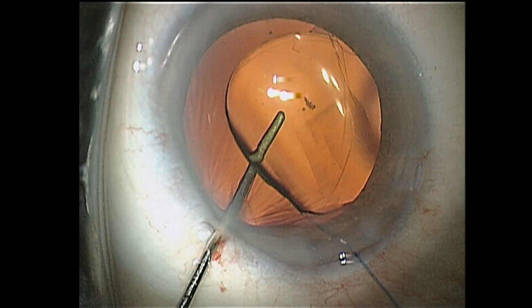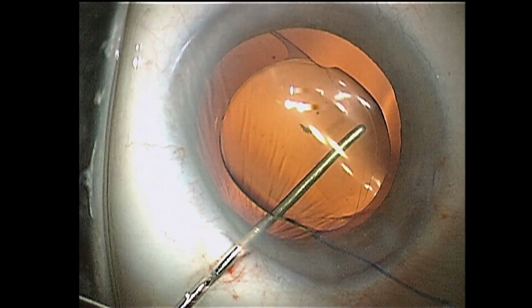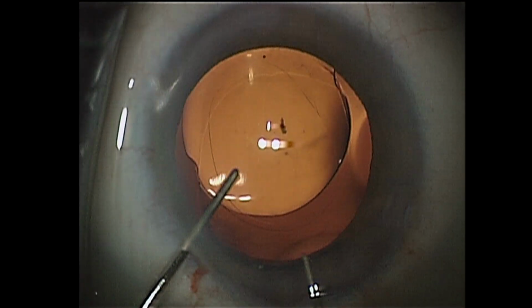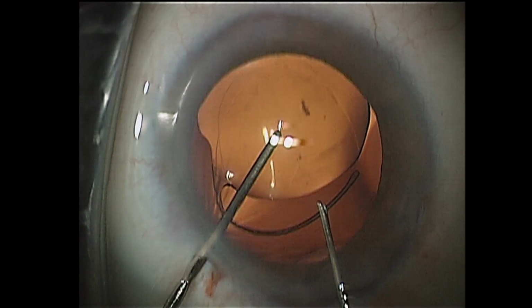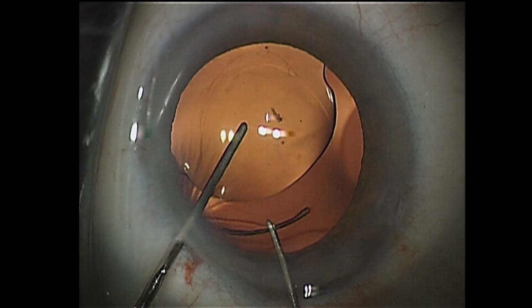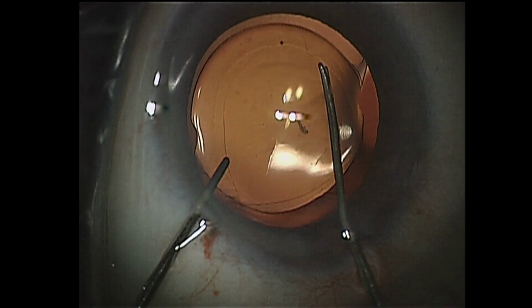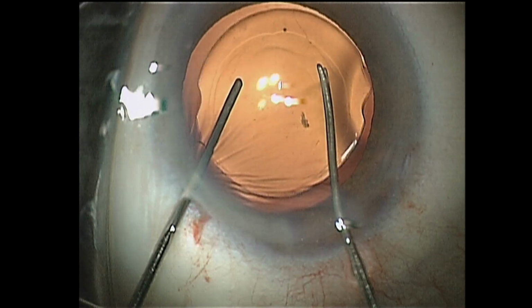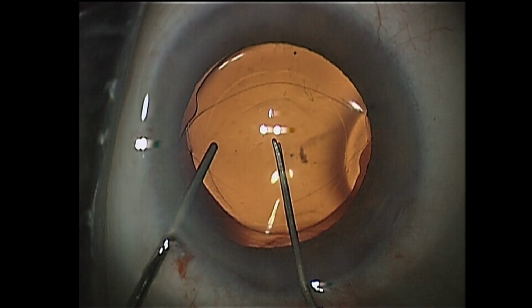Using a Y spatula to gear the trailing loop, while a blunt spatula is positioned on the anterior optic surface, the trailing loop is also inserted into the capsular fornix while slightly rotating the IOL. After recentering the implant, the optic is entrapped in the posterior capsulorhexis by gently pushing on the optic periphery 90 degrees away from the IOL axis.